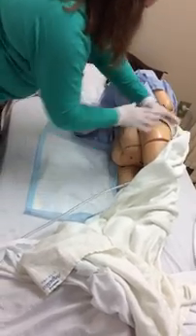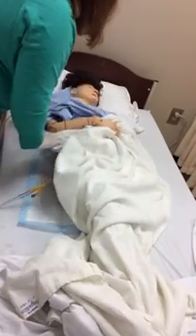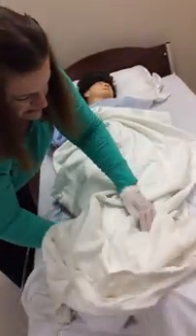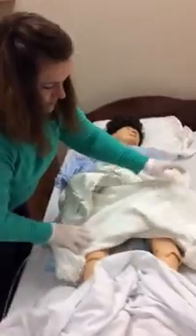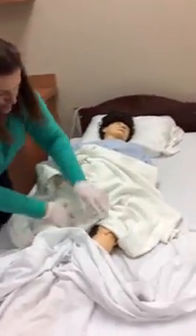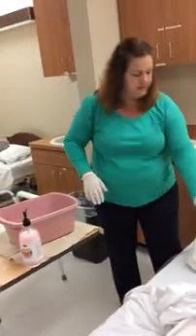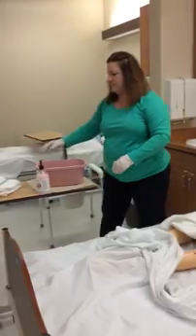I'm putting this pad underneath her buttocks and her thighs so we keep the bed dry. I'm going to turn back. Ready? 1, 2, 3. You're not too close to the edge of the bed there. I'm going to uncross your legs. When you're doing this skill, we're lifting the blanket up from the bottom, not from the top.